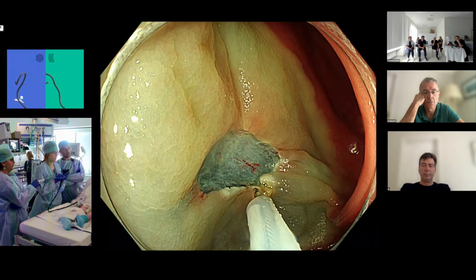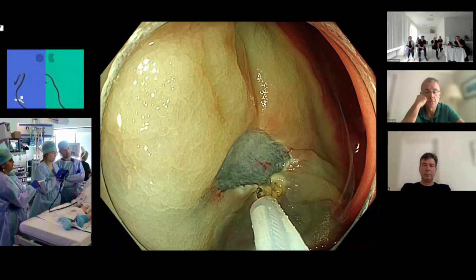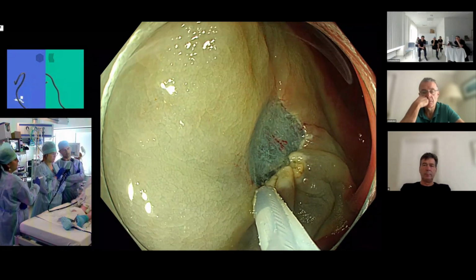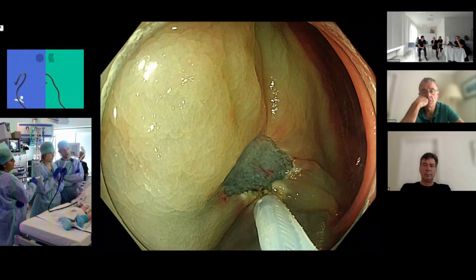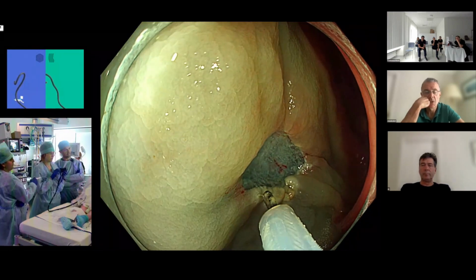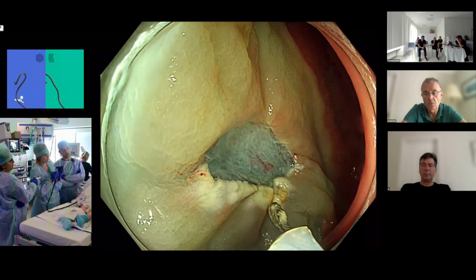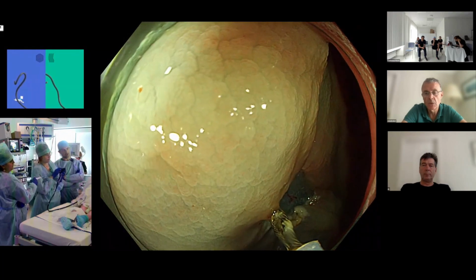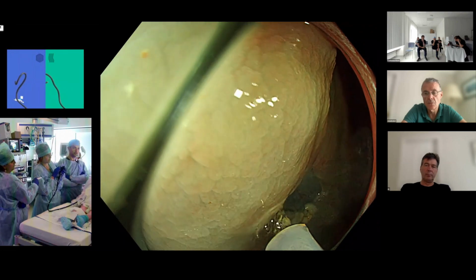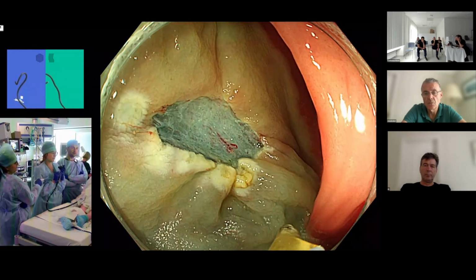You may be surprised to know that there's a significant amount of evidence for what you say. There is evidence that en bloc resections are more likely to bleed after the procedure than piecemeal resections. The reason for that is not particularly clear, but it's presumably something to do with the bigger pieces that people are trying to take and the further depth of thermal injury in that situation. So that is part of the equation here. Other people got other views on that? So the thermal injury is minimal here, isn't it, David? Well, do we know that? I think the thermal injury we're talking about is what is invisible underneath there, and the thermal injury to deep submucosal vessels, which later herniate. So, while I agree with you, the thermal injury to the margin is minimal, I'm not sure we know about the deep injury and the depth of diathermy injury.